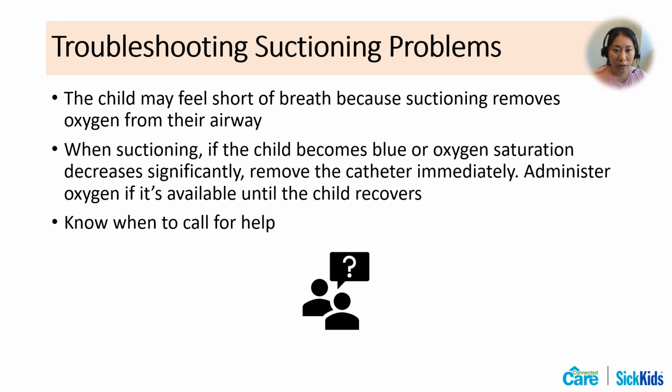Suctioning may cause a child to feel short of breath as it removes oxygen from their airway. If the child ever becomes blue or desaturates significantly during suctioning, remove the catheter immediately. Administer oxygen, if available, until the child recovers. It is important to know when to call for help.